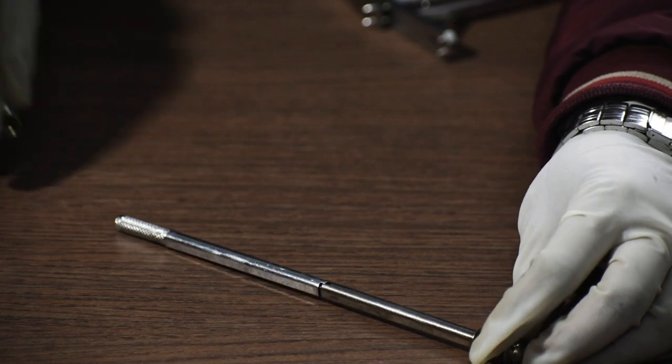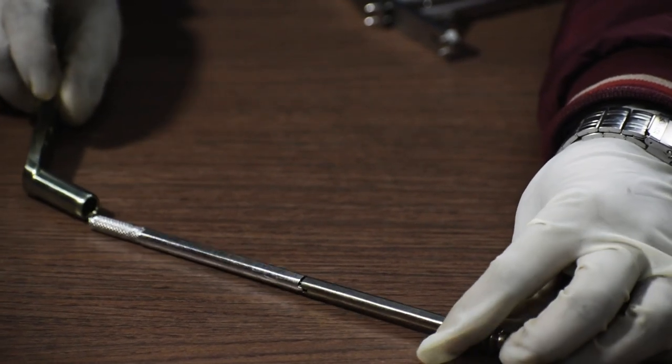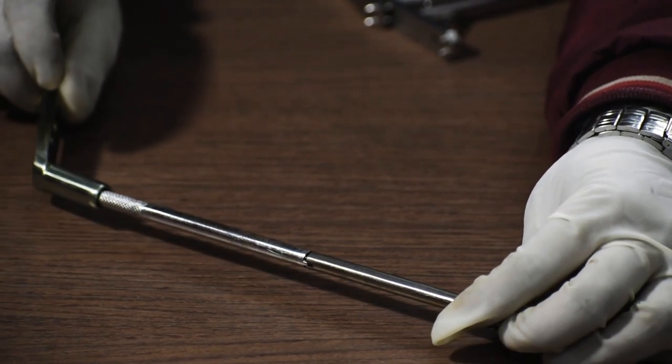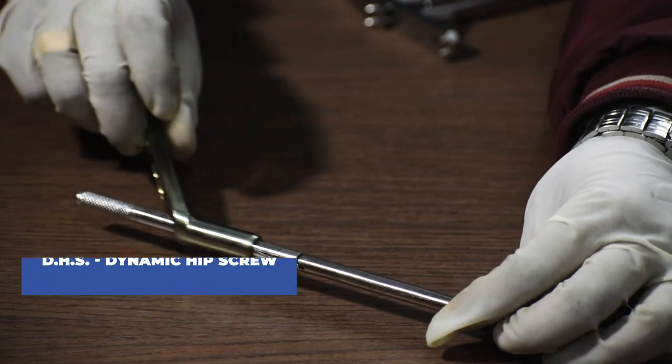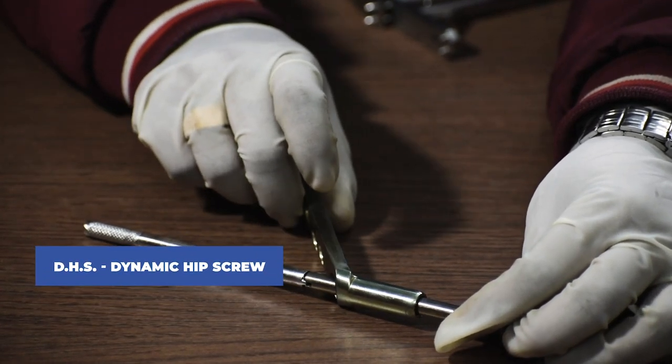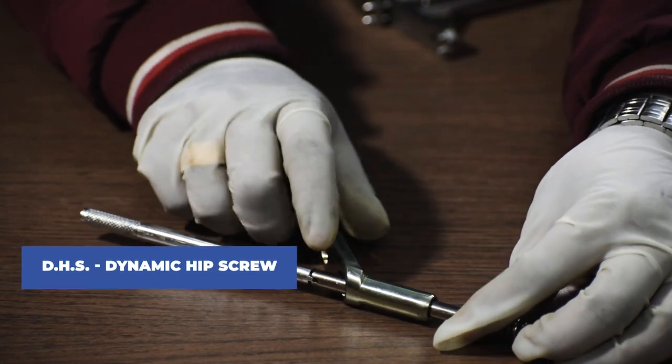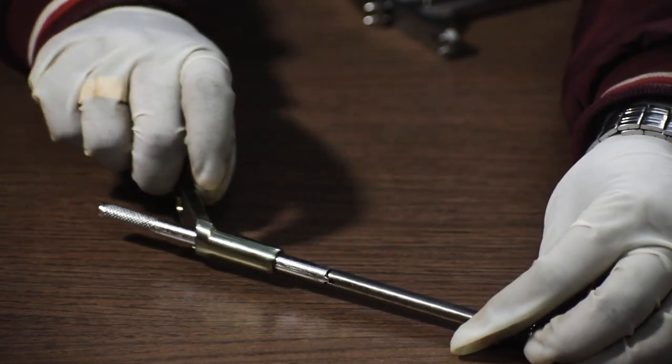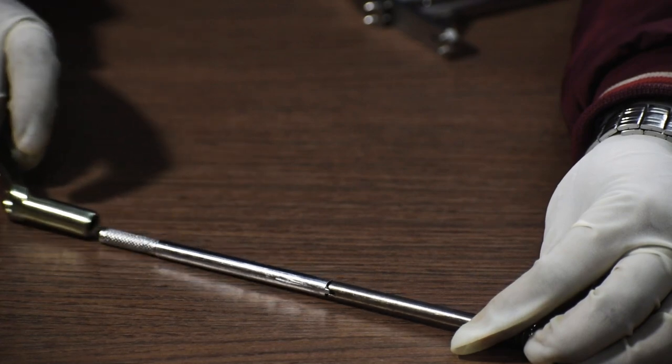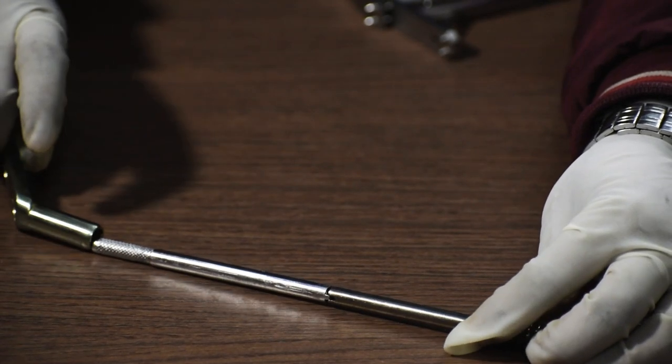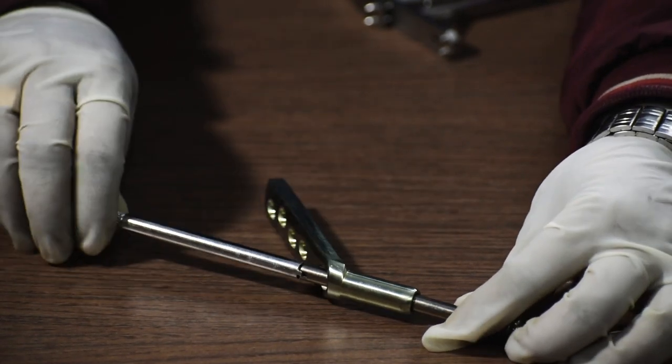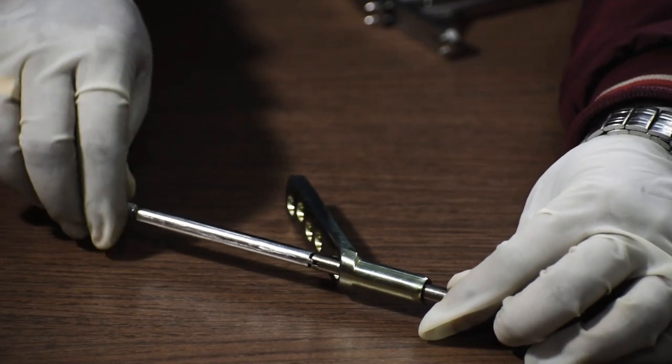Now we use a coupling screw or a plate holder to make the fixation of the DHS plate easier. Now comes the DHS plate, long or short barrel depending upon the fracture will be attached with the lag screw with the help of this coupling screw or the plate holder. This plate holder helps the DHS plate to slide through and get attached to the lag screw without any obstruction smoothly as you can see here.